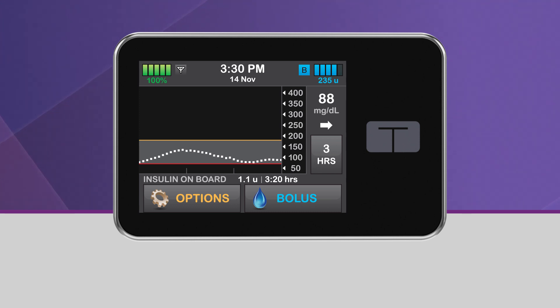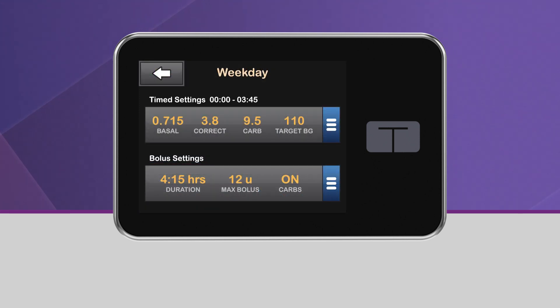In order to turn on Control IQ Technology, you need to have an active continuous glucose monitoring or CGM session and an active personal profile with CARBS turned on.